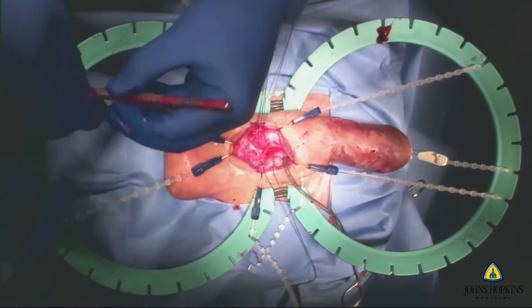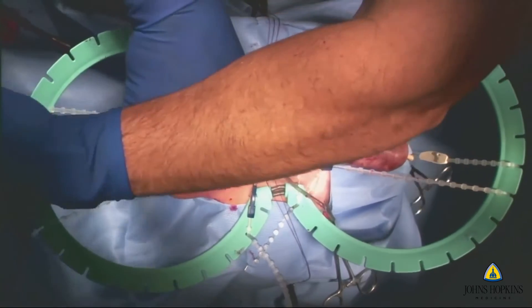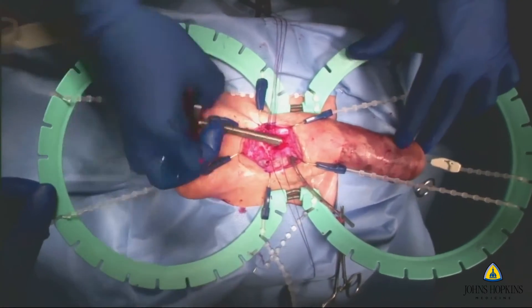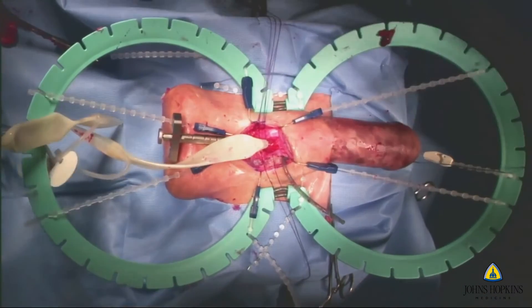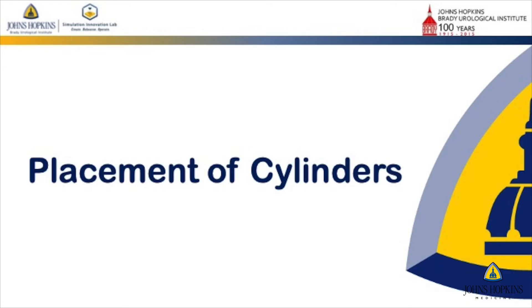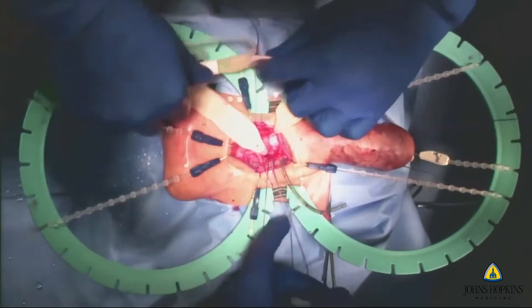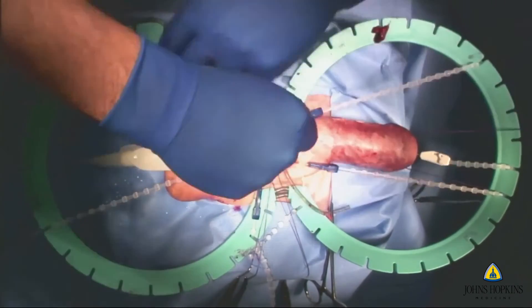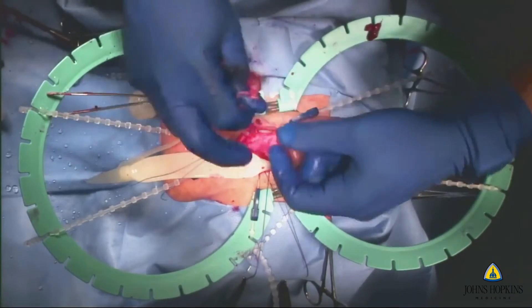This is the passage of the sutures to guide the inflatable penile prosthesis that's being placed in this model, and then finally, placement of the cylinders inside the corpora. If you look at the video, you can see that the surgeon here is performing this simulation very similar to how they would actually perform the real procedure. And that is our goal.